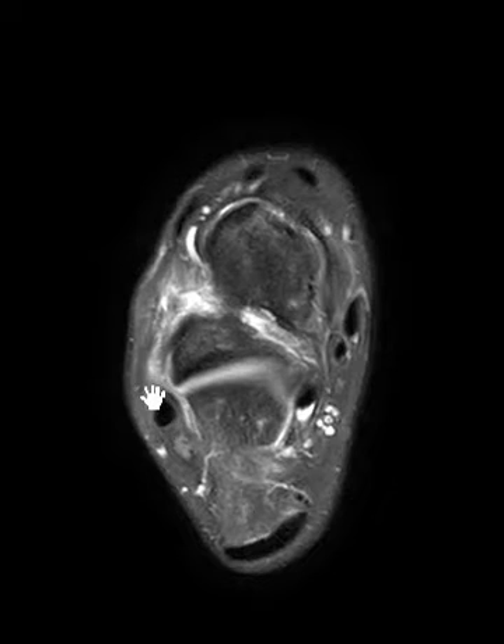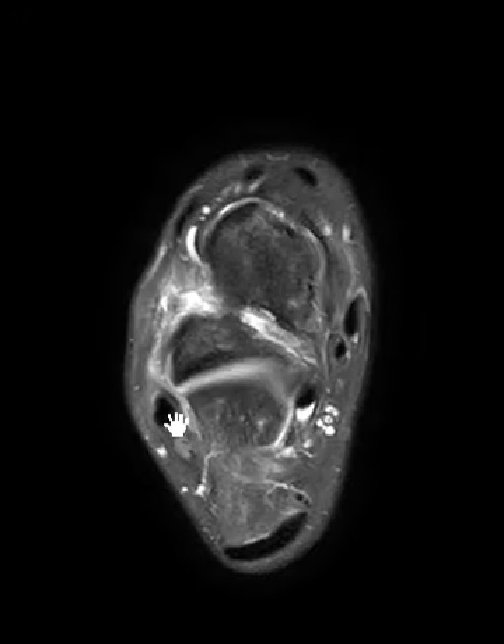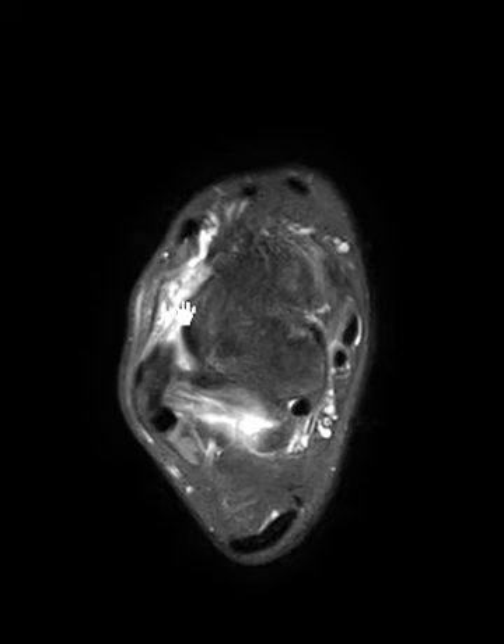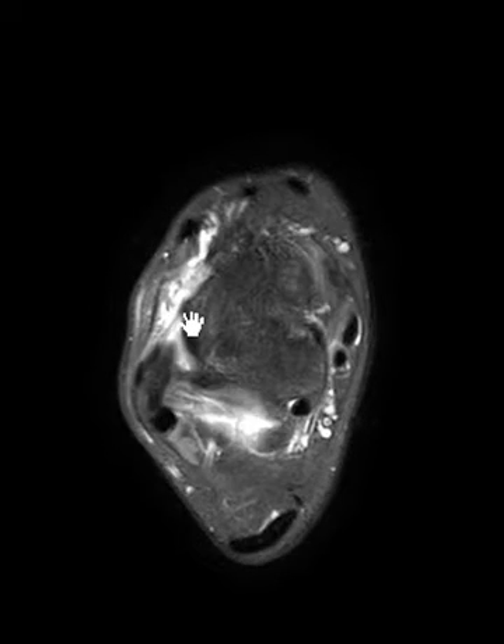The calcaneal fibular ligament is more posterior — just a little linear band coming up underneath the peroneal tendons. There's a subtle linear band coming off the calcaneus below, going obliquely up to the bottom of the fibula. It's hard to see in this view, but that one's intact. We still have this fluid to contend with that is not completely related to a rupture, so there's more to the story.